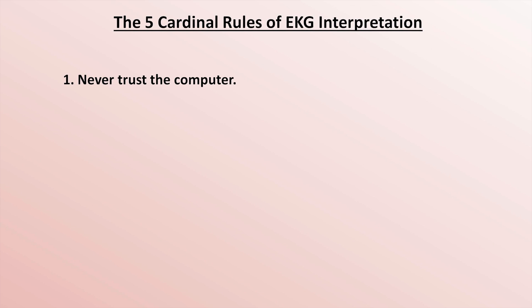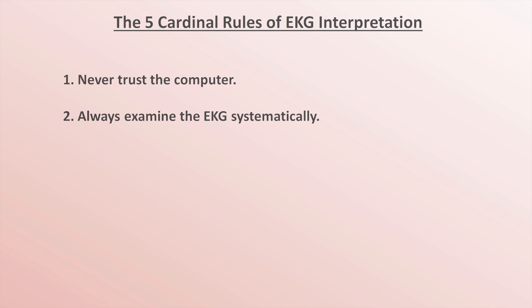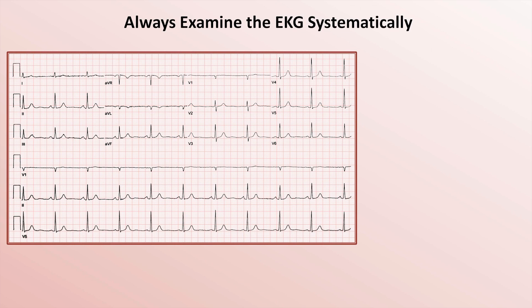Rule number two: always examine the EKG systematically. I have another video talking about my preferred systematic method in more detail, but here's a brief overview using this EKG as an example. Step one in the systematic method is to identify the rhythm. There are five parts to this. Part A: is the rhythm fast, slow, or normal? In this example, it's about 60 beats per minute.